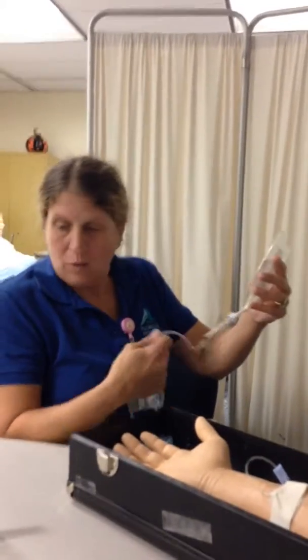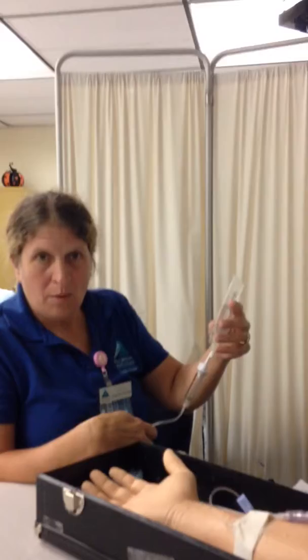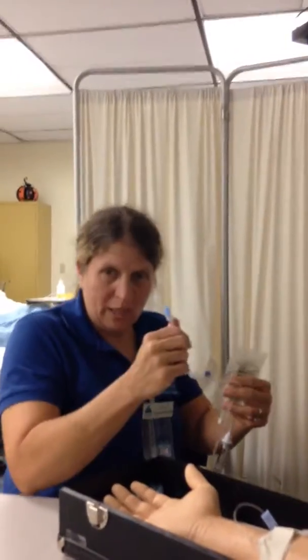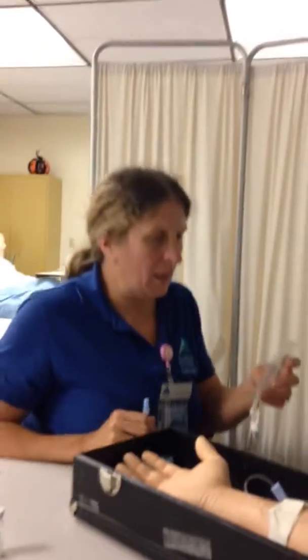Okay. And I will also label my tubing with the date, the time, and my initials. I'm going to put the alligator clip on it afterwards, so the next person can come and use the same tubing to give their antibiotics.